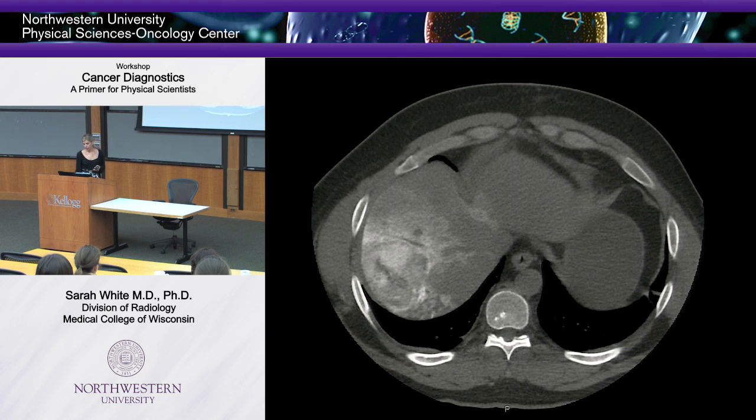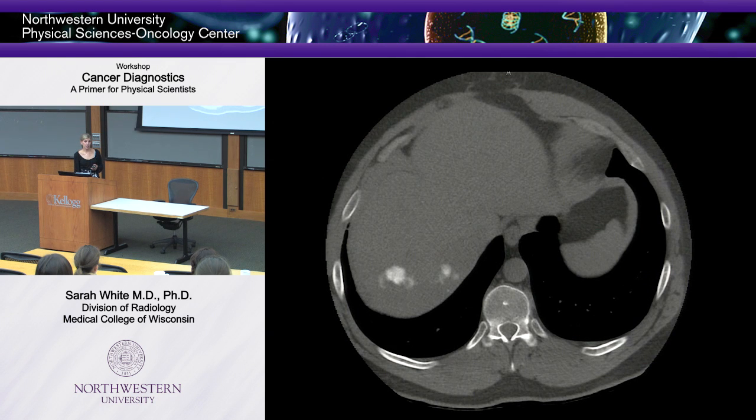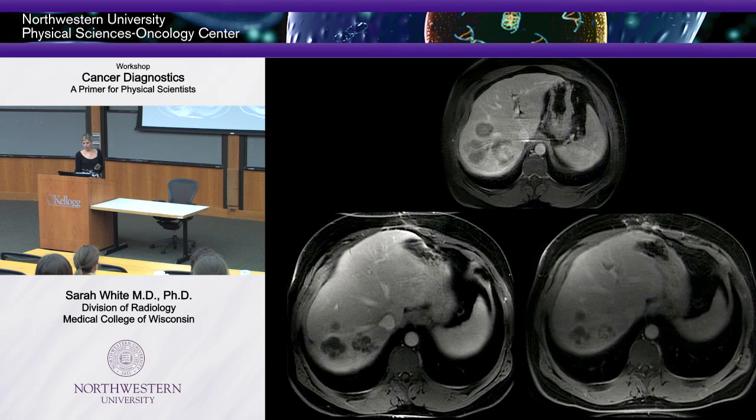And so this is what he looked like after we treated him. This is a couple months later, okay? It's retaining that Lipiodol. That means that in this patient, that drug got taken up into those cells, and those cells are just holding on to that stuff. And these are a sequence of images. This was before. Now we're back in the axial plane. This is about 3 months after, and this is about 6 months after.